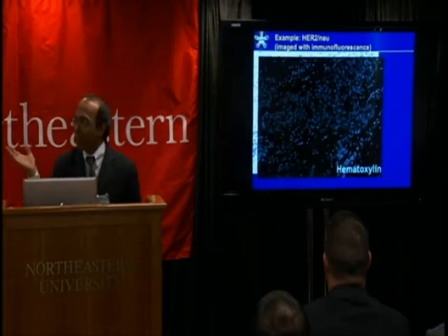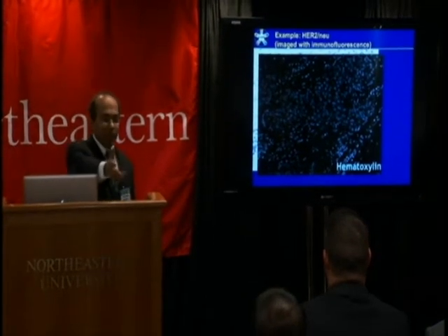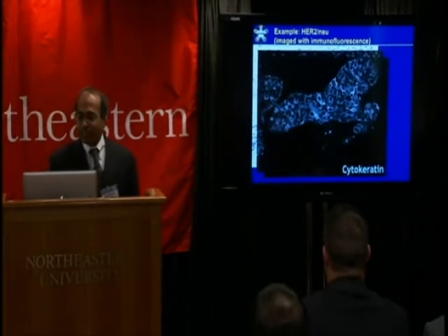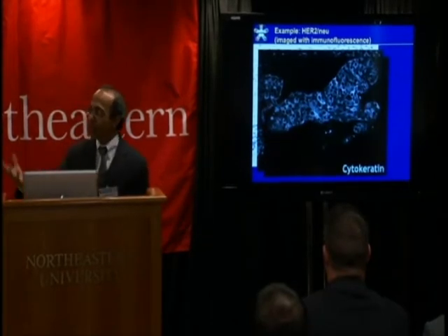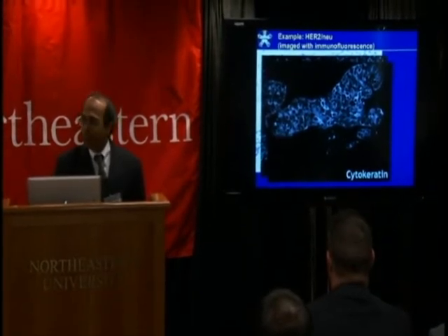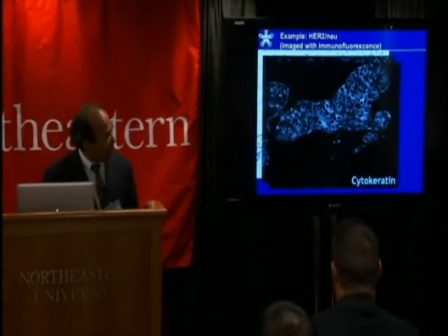gives you all the cell nuclei. Now I can get someone like Yusuf and say, can you segment that? Okay, and he did. And then another channel gives you another molecule of interest, the cytokeratin. This highlights all the tumor cells. Doesn't that look like a leaping tiger there?